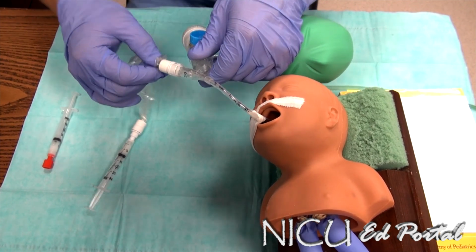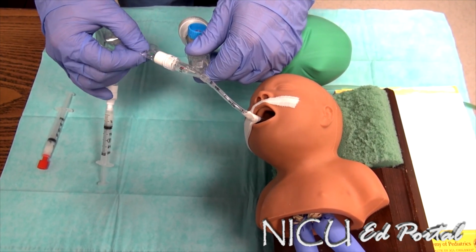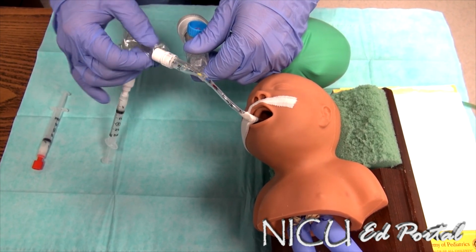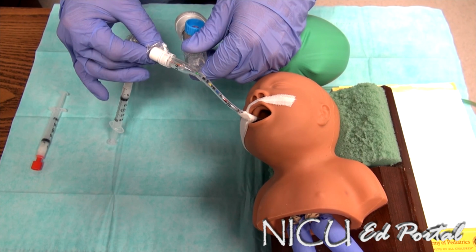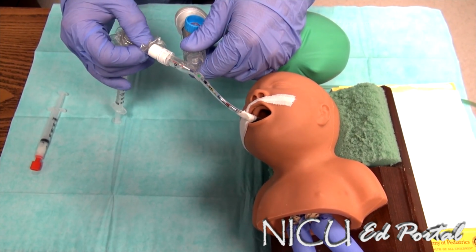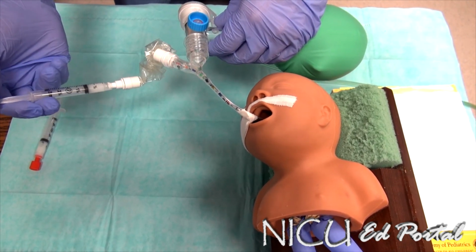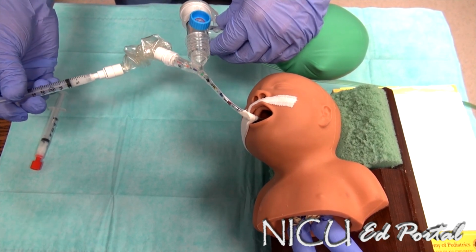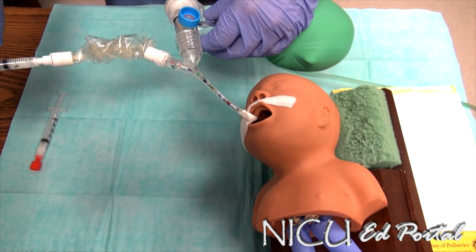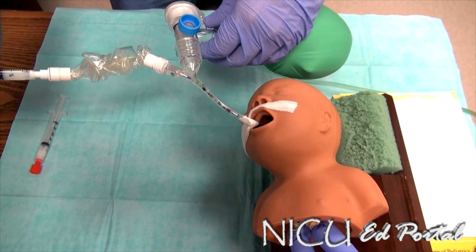Like mentioned before, we will be matching our numbers up on the catheter to the ET tube. So I will be matching up our 14 and 14 on the ET tube, advancing about a half centimeter beyond that, and now administering the surfactant. I'll depress the syringe, administering the surfactant. You want to take around 15 to 30 seconds if possible to administer the full first aliquot.